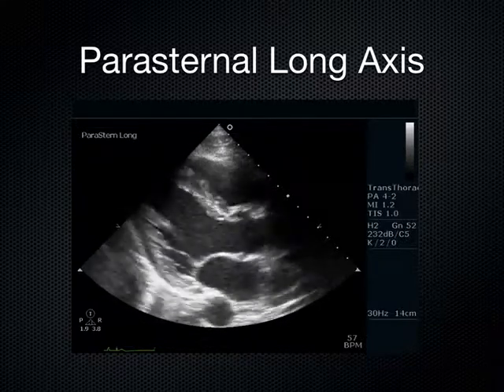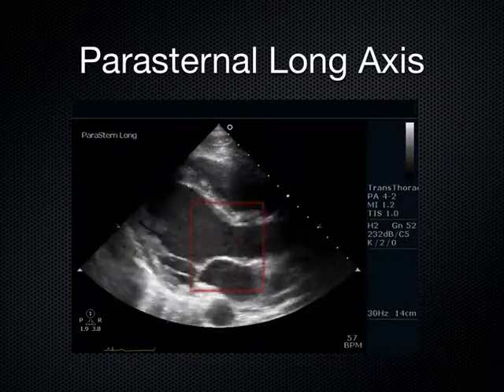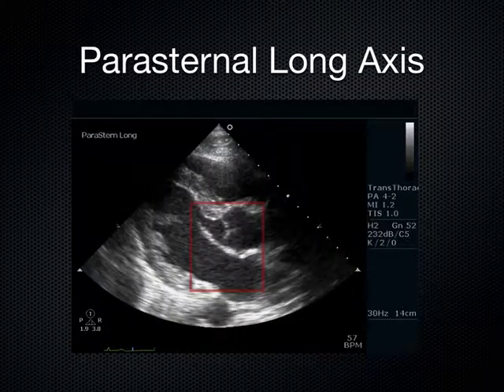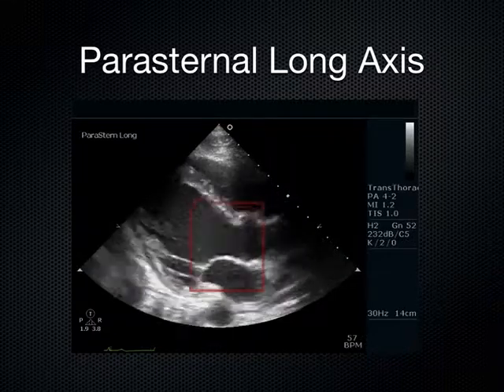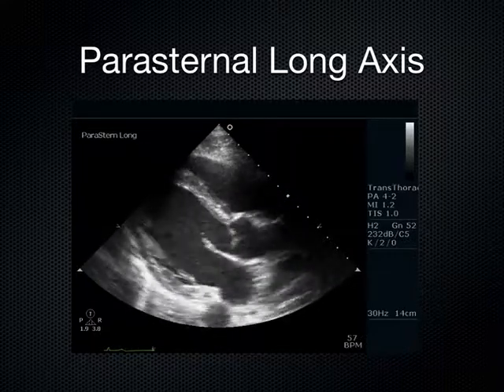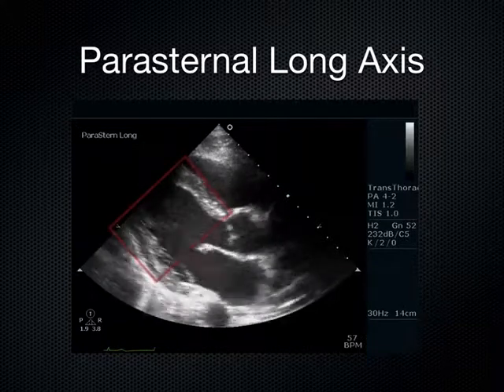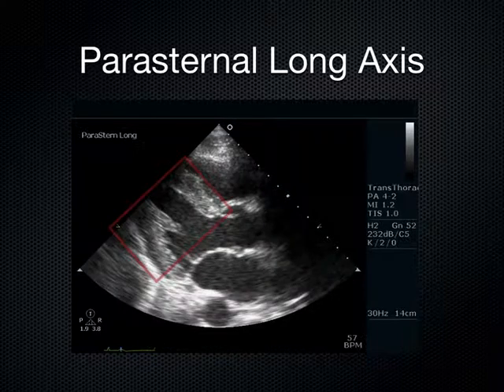If their blood pressure was 70, I'm looking at that mitral valve, I'm saying, yep, coming up and smacking that septum right there. See that? Right there, actually. And you could do that in your machine. You can freeze the machine, and you can back it up or go forward with it. You're going to do that today quite a bit. So there's that mitral valve smacking that septum. Now we come over and look at that interventricular septum and its movement towards that left ventricle.